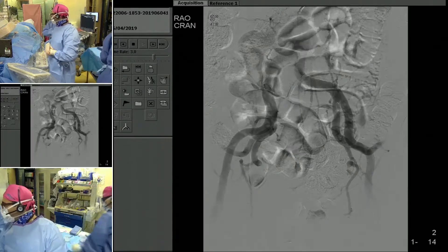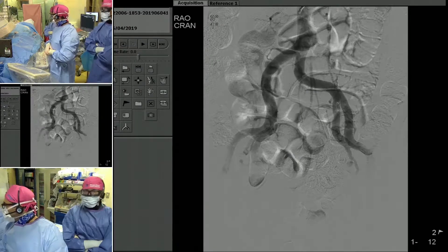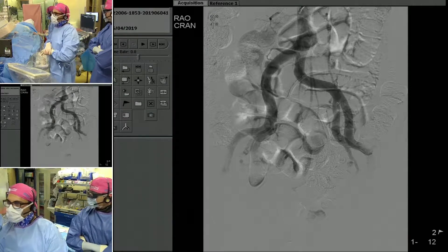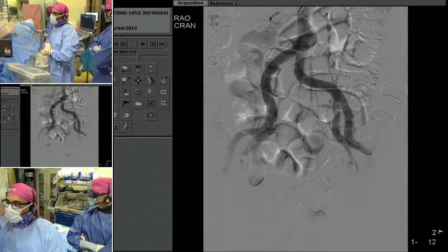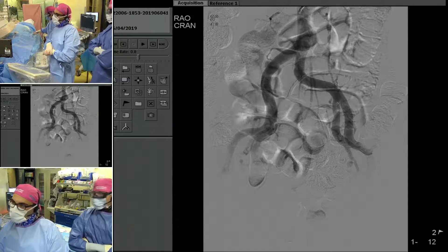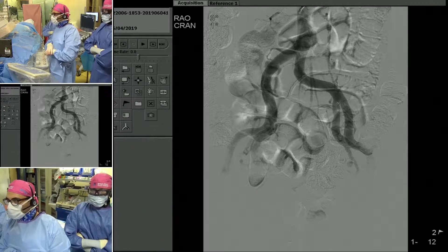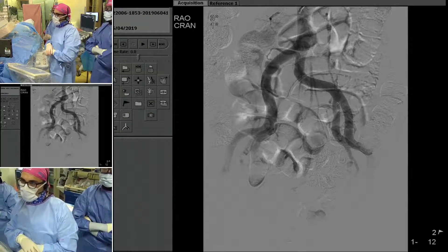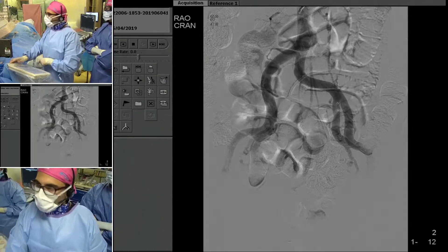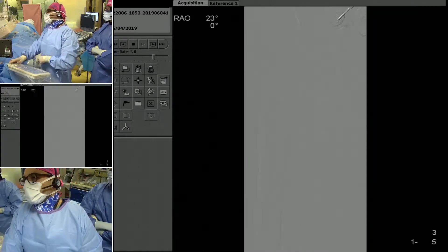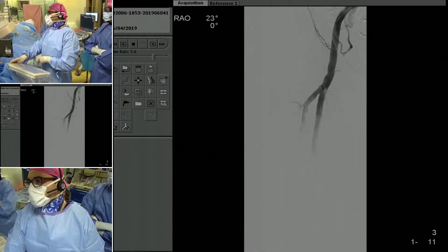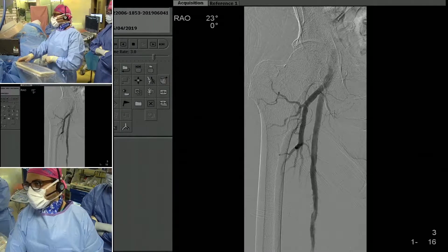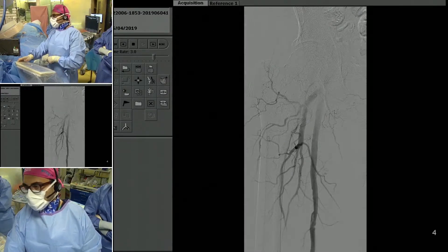Just a couple of technical points. He's a relatively tall gentleman, so we accessed mid-forearm to gain about 10 to 15 centimeters in terms of length. We went ahead and did an aortogram, which showed that the inflow is intact. We subsequently did our runoff, which shows that the proximal vessels are fine — the common femoral, profunda, and proximal SFA are patent.